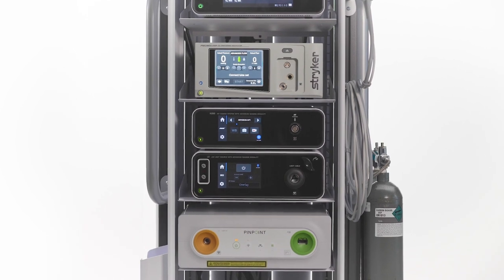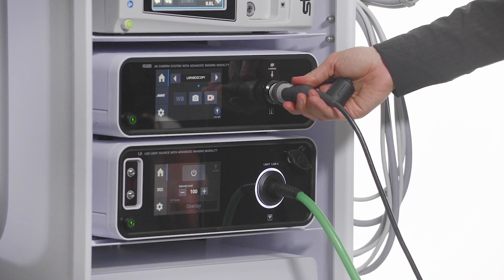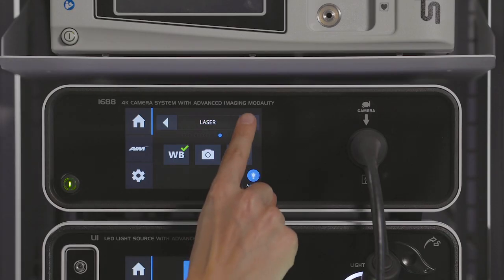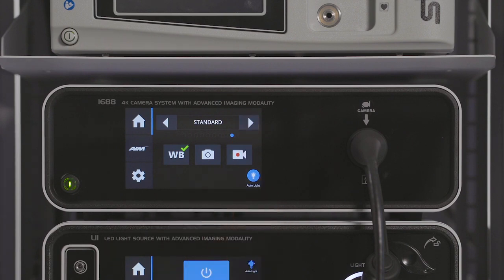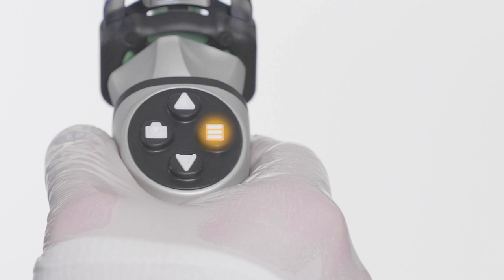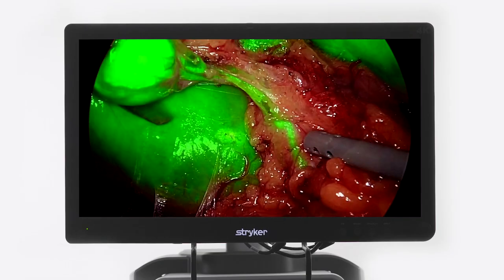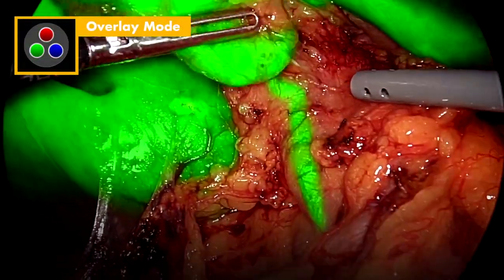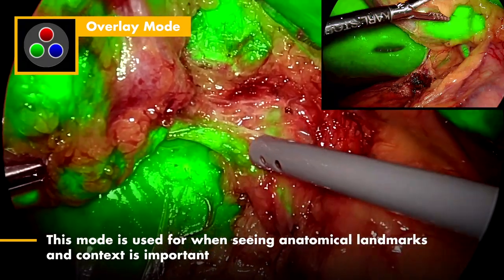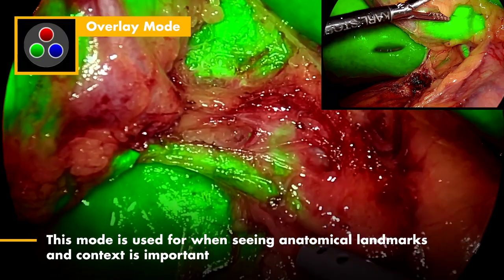The 1688 platform features 4K SPY fluorescence technology, which enables surgeons to see beyond the limits of the human eye. SPY modes are only available when the camera control unit is set to standard or laparoscopy. Toggle in and out of SPY mode by pressing the menu button on the camera head. Once activated, the default SPY mode is overlay mode. Overlay provides a fluorescence image over the white light image, with green fluorescence overlay, and the surrounding anatomy remains visible.